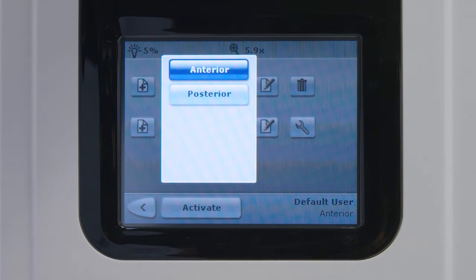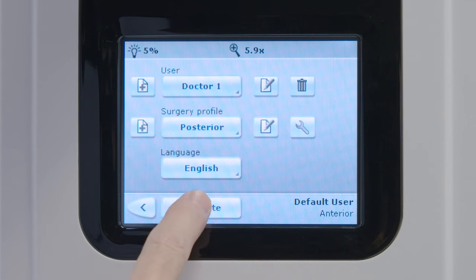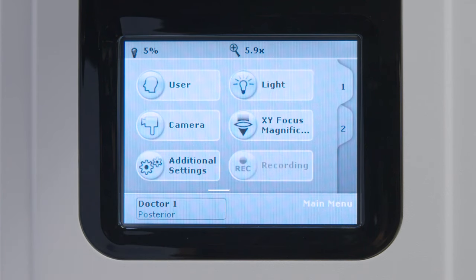Select the Surgery Profile icon for the surgery profile you want to view or modify. Select the Activate icon, then select the back arrow to return to the main screen with the new user and surgery profile active.